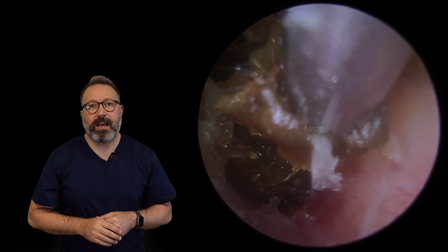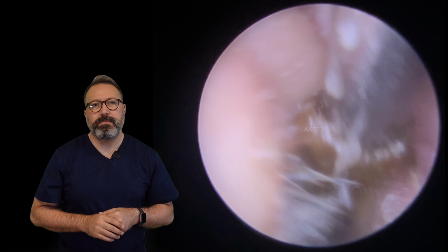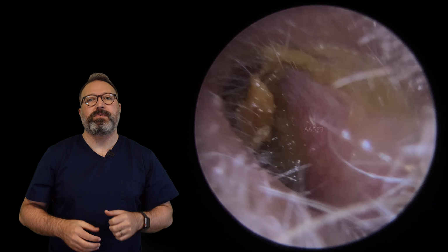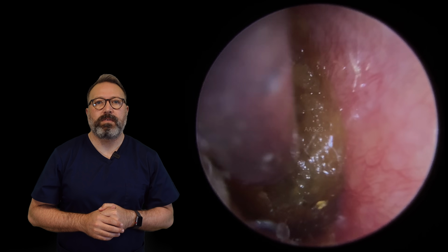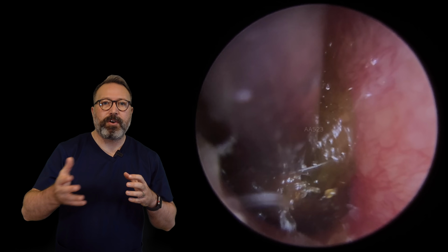So you can see we've managed to get that long tapered section from the front. Out that comes. There we go. A little bit of skin hanging on the back end of it was what's attached to that plug there. And let's just take this away. We'll just work down this left-hand side now. You can see that layer coming off the canal wall.